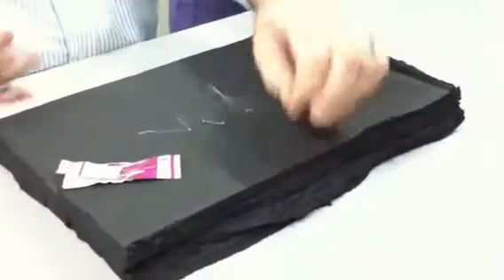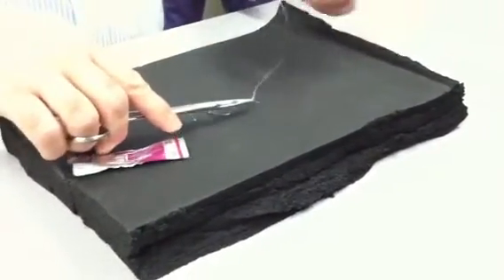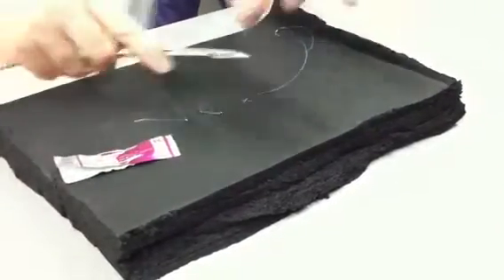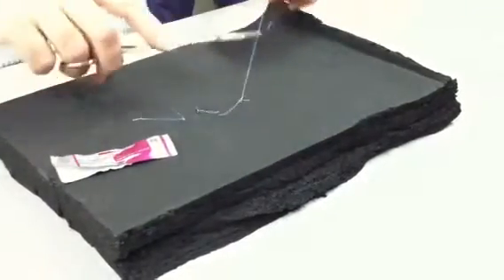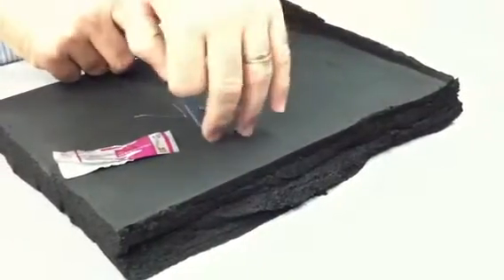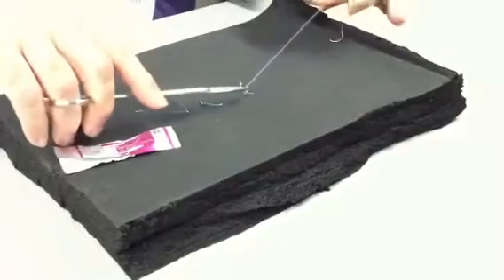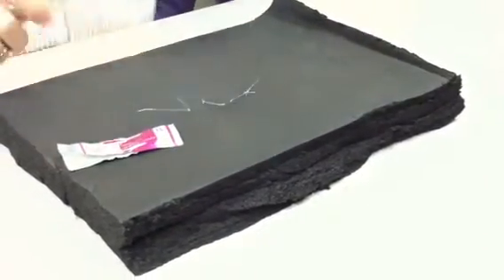So there's our surgeon's knot. One throw inside the V, grab the tip, make it even tension, and then again I'm pulling a little bit on the slant rather than back and forth this way. That's one surgeon's knot. And I did my two square knots.